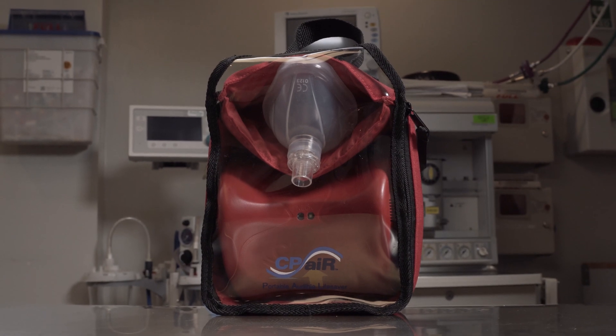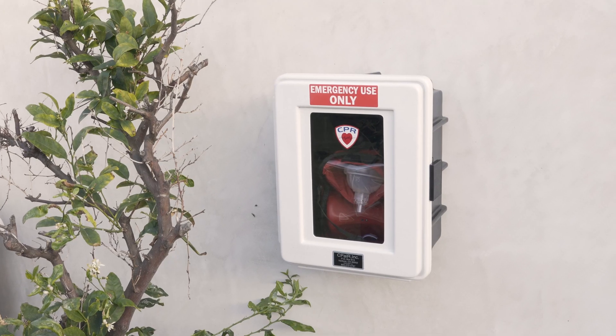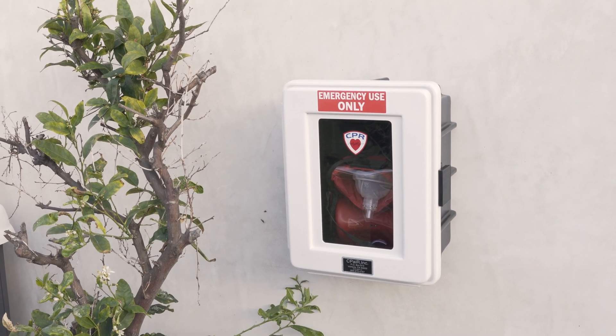The PAL should be located in an obvious, accessible area of your home or office. Notice here that the PAL is housed in an optional outdoor enclosure for pools, hot tubs, etc.